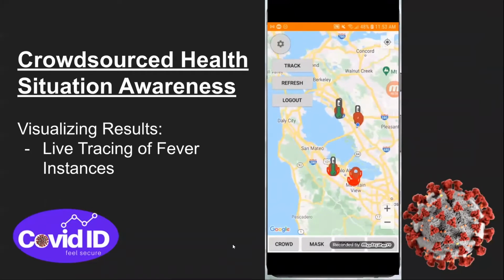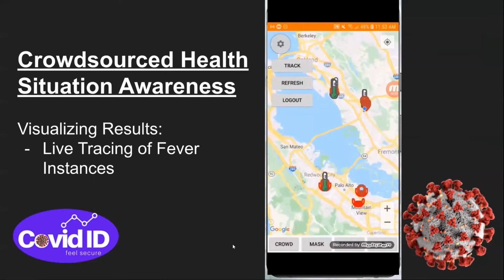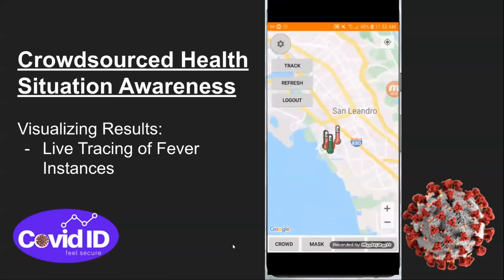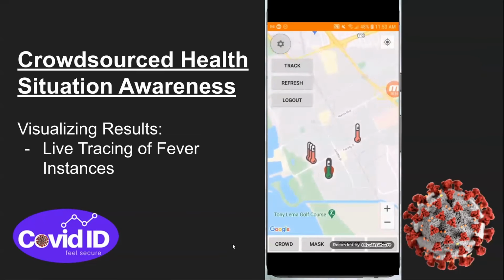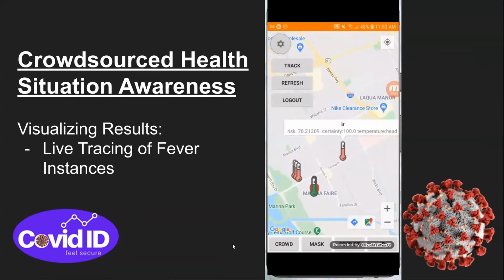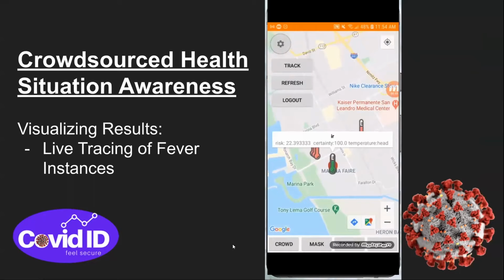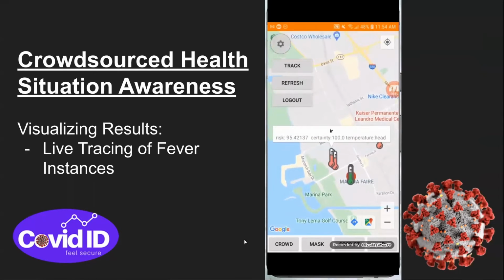In addition to data about possible fever instances, the COVID ID Android application also uses several other machine learning-based modules to monitor other possible COVID-19 risk factors, such as low mask usage, high crowd density, or insufficient social distancing measures. All of these records are consolidated into one Maps interface to maximize the amount of information that users can draw upon to increase their situation awareness and make safer choices.